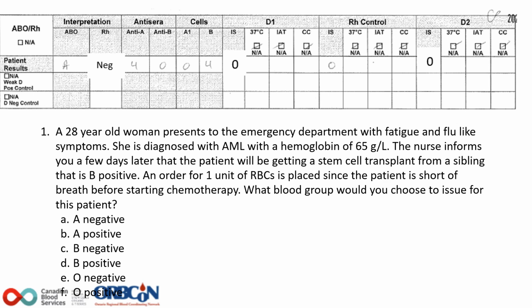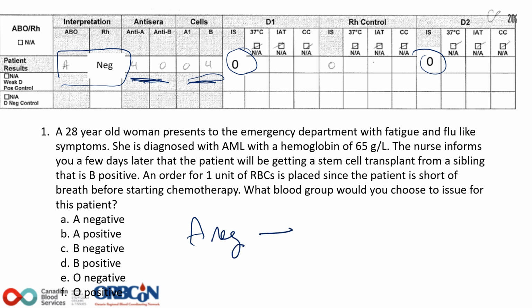So in looking at this, let's just first look at the ABO and Rh typing. Forward typing looks good. We have a forward typing of group A, reverse typing matches with an anti-B. They're Rh negative with 2 monoclonal RHD reagents, so therefore they are A neg. So we have a person who's, sorry, my handwriting is not great today. We have a person who's A neg going to be B positive.